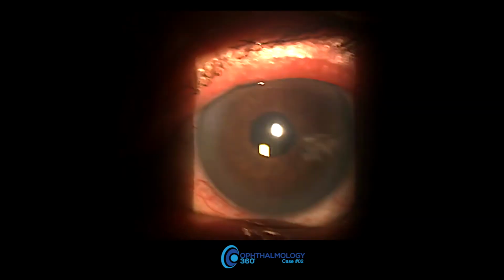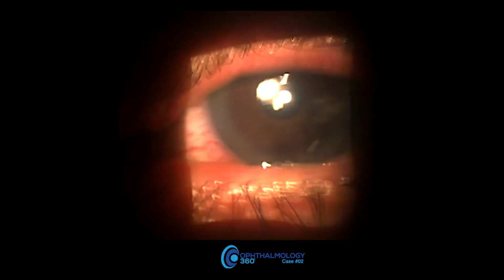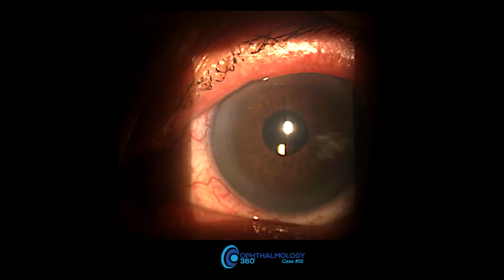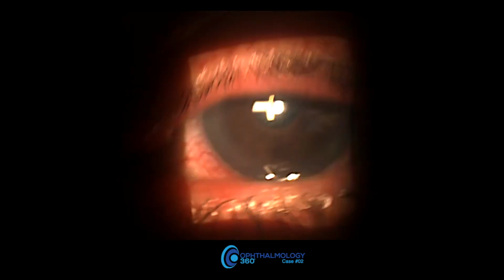And I will often now use my finger to counter pressure, and you can go in 2 bevel lengths, and it's ideal. You can't always control. Sometimes you go a little bit. When I first started, I was going a little bit deeper. But 2 bevel lengths usually get you in there pretty smoothly.